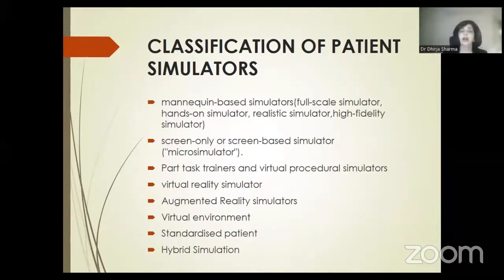Part task trainers are the kind of simulators we use, say, for learning how to put in IV lines, the IV arms, or when we learn how to put in CVPs, or the mannequins for doing cricothyroidotomy, for doing tracheostomy, and we may even use animal models for the same.